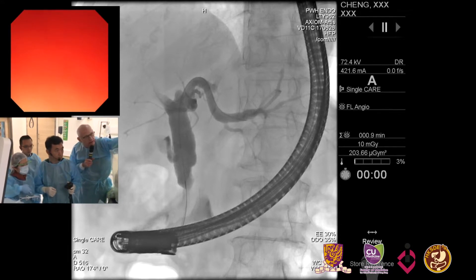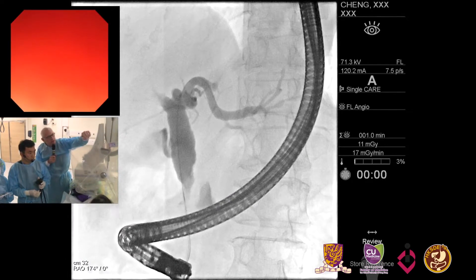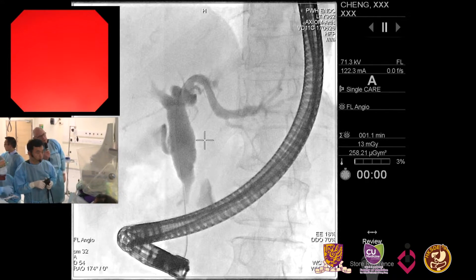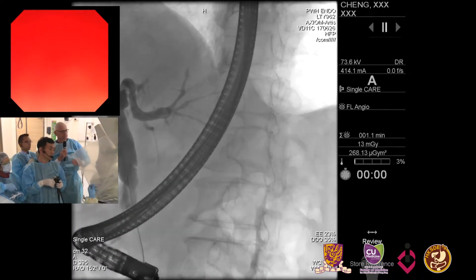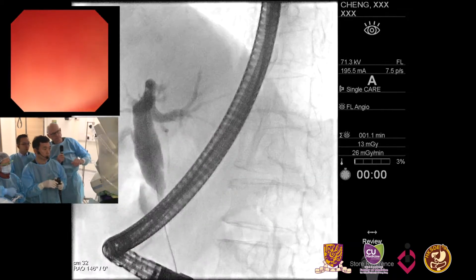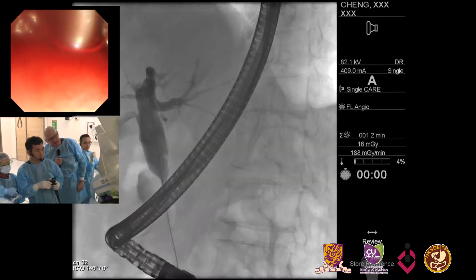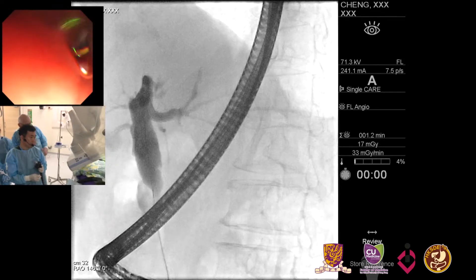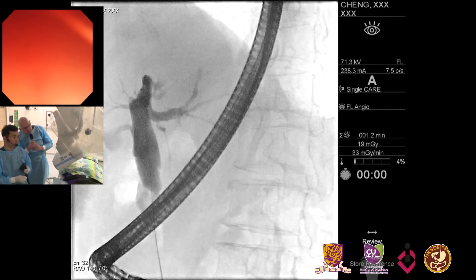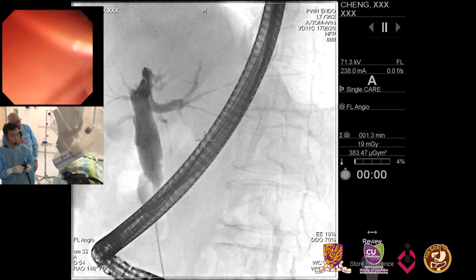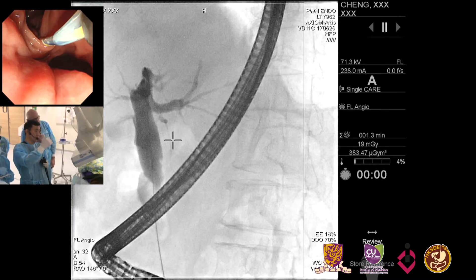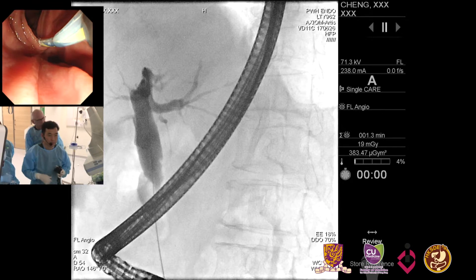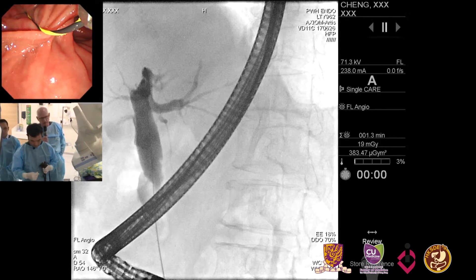We're trying to rotate the C-arm. I can see the cystic duct a little better but I'm not sure exactly where it's taking off — probably on the right side right around there. Can we rotate more? It looks like there's a small filling defect, maybe about an inch and a half above. There's a little irregularity, and probably around that area or a little bit above is the cystic duct takeoff. So that information doesn't change my decision about the method of stenting.